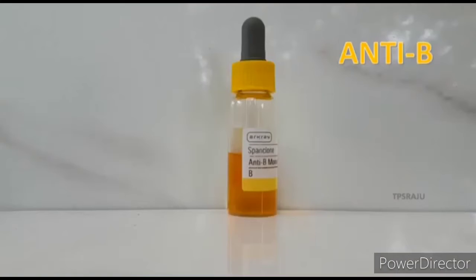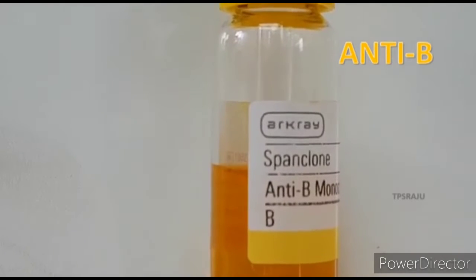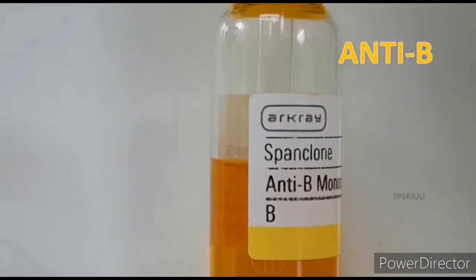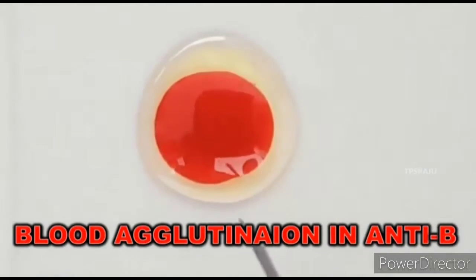Anti-B is a serum which is yellow in color, which is responsible for recognizing group B blood. So take one drop of serum B and put one drop of blood into that.